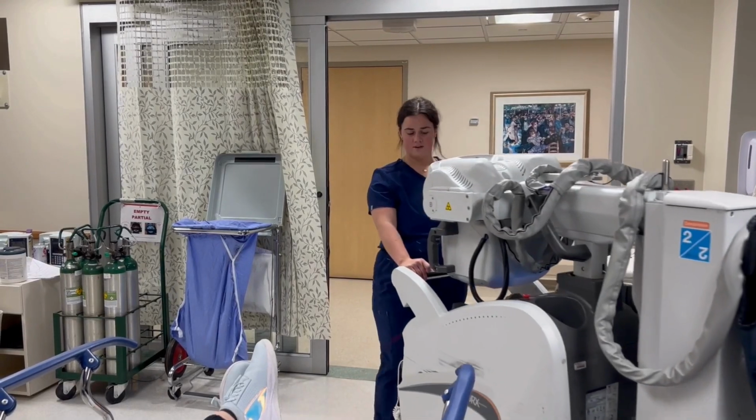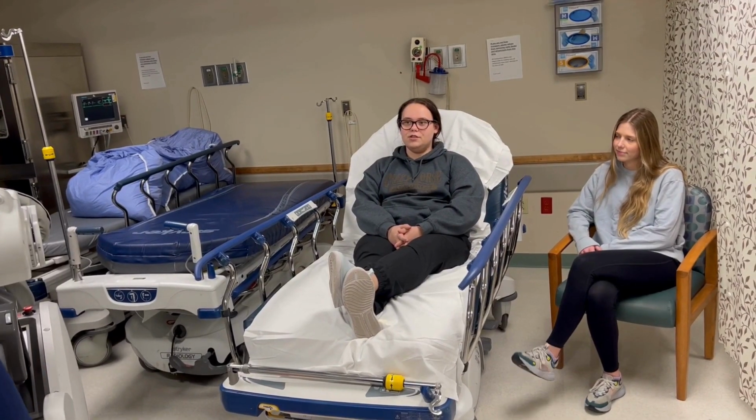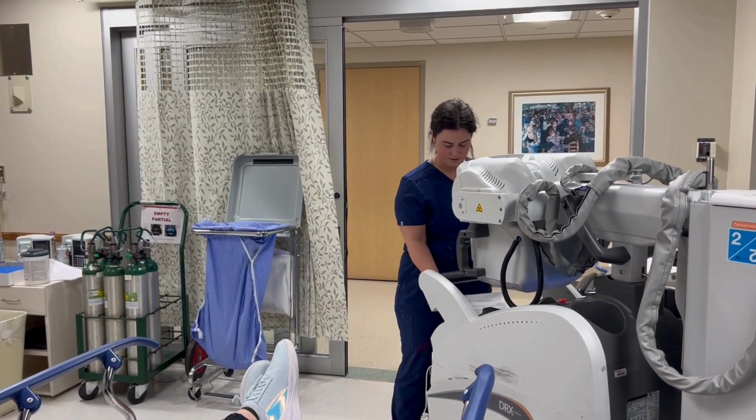Hello Maggie, my name's Faith. Can you just tell me your last name and date of birth? Smith, 3/14/2000. Alright, we're just gonna get a quick chest x-ray right here in the bed, okay? Okay.